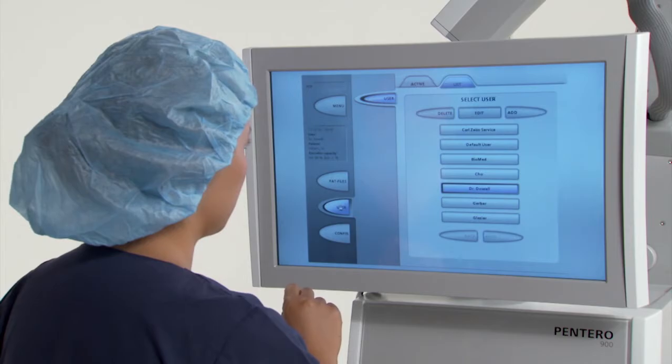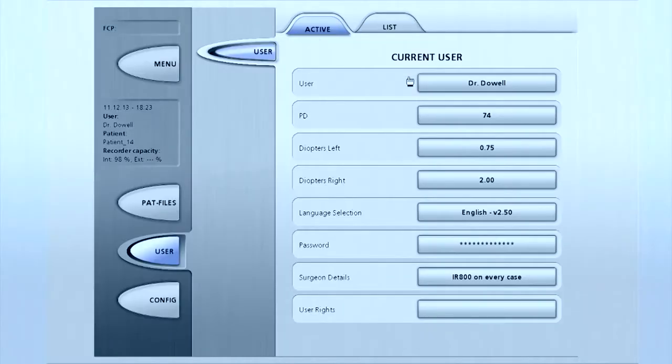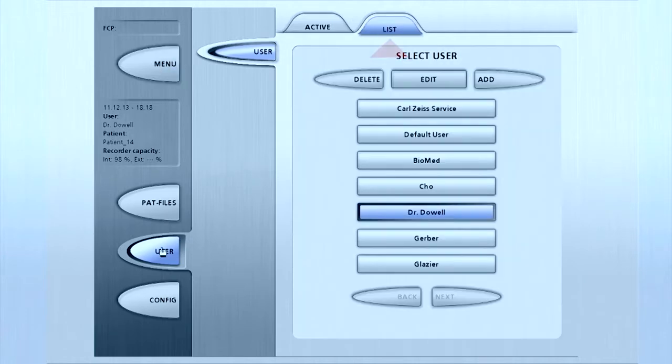In the user submenu, touch active to view the most recent user name settings. Touch list to add a user profile.